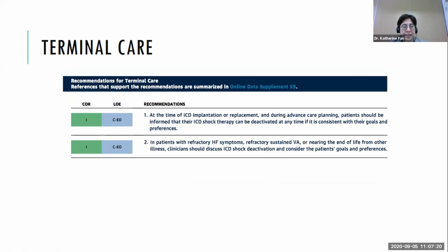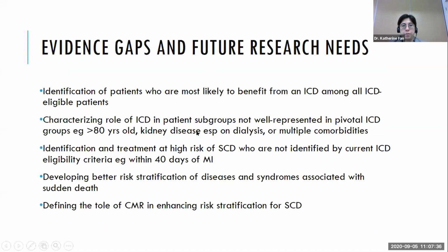Also, terminal care is essential for patients with severe heart failure who are not eligible. And the other thing they talk about is ICD termination at end-of-life care. So this is also quite important, and this is outlined in the guideline as well.